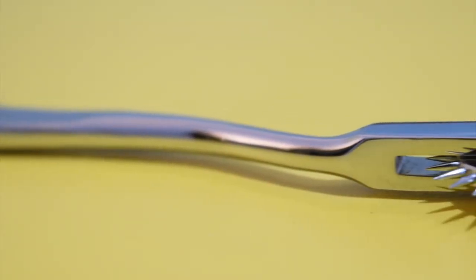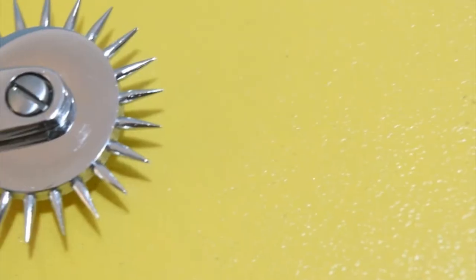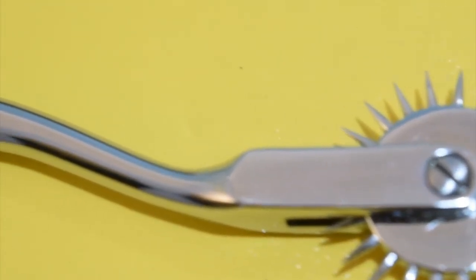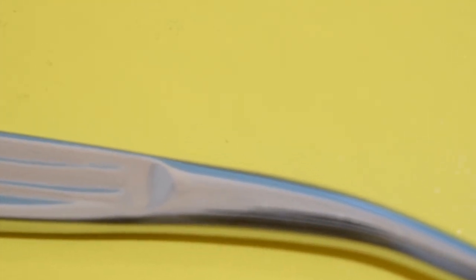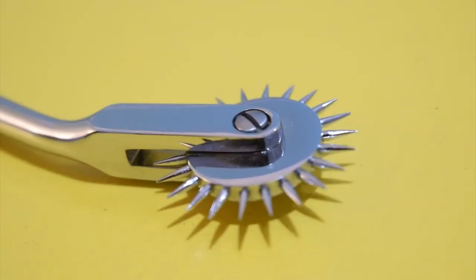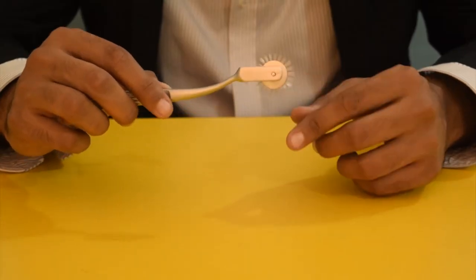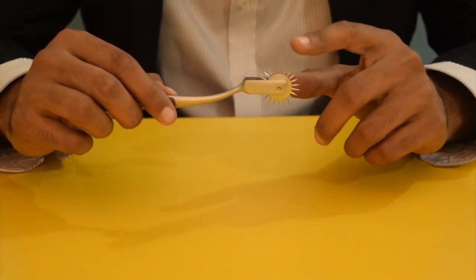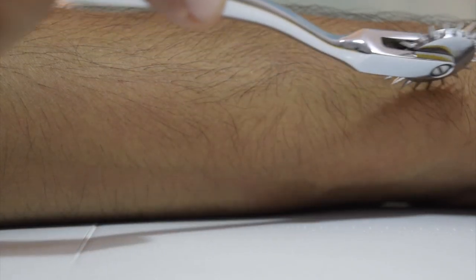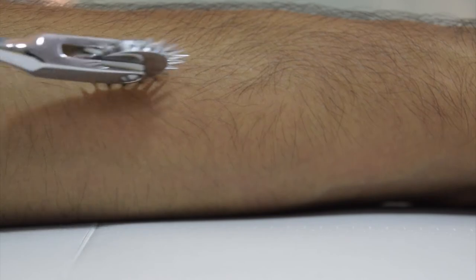The Wharton Birch Pinwheel is designed to test nerve reaction as it glides across the skin. Made of stainless steel with a handle of approximately 7 inches in length, the wheel has evenly spaced radiating sharp pins and rotates around as it rolls across the flesh. Very gently roll this wheel of sharp little pins over your partner's skin, generating a unique sensation which many people really respond to.